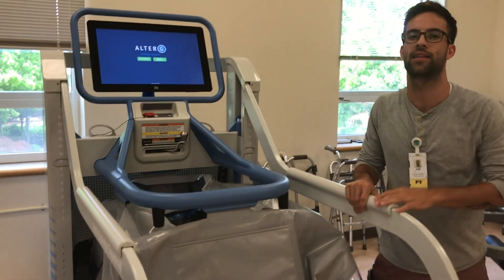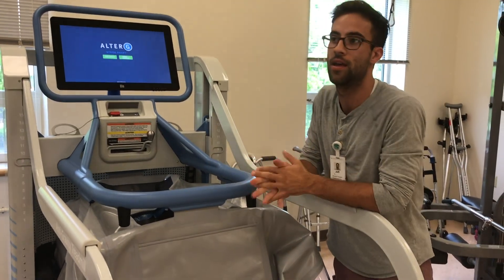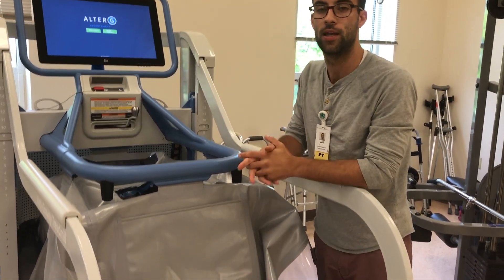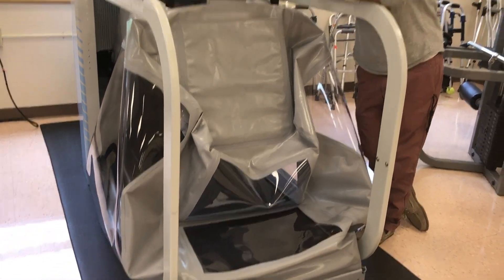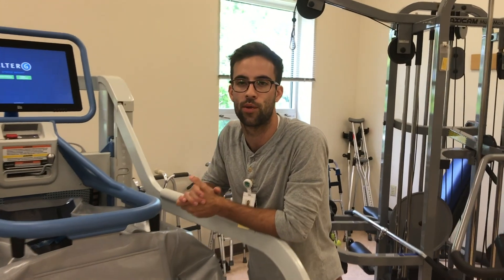Once the machine is on, it calibrates their weight by filling up with air. It may try to lift you off the ground a little bit, but it's really just assessing how much the patient weighs. From there we can put in a percentage of how much body weight we want the patient to be practicing and standing on themselves.